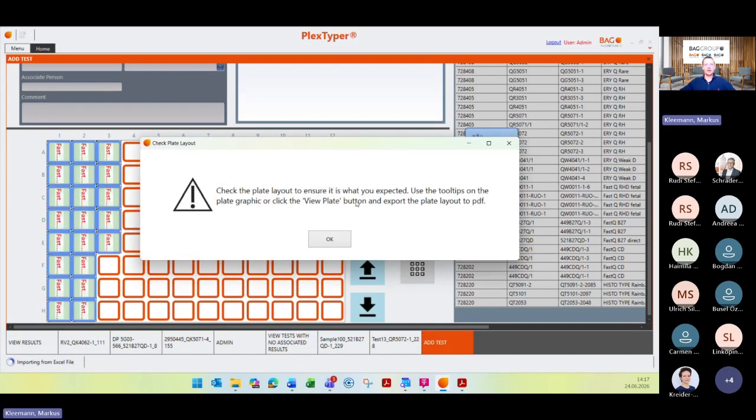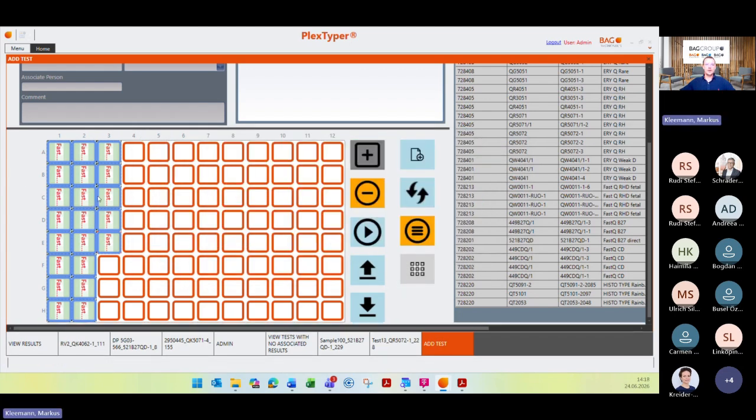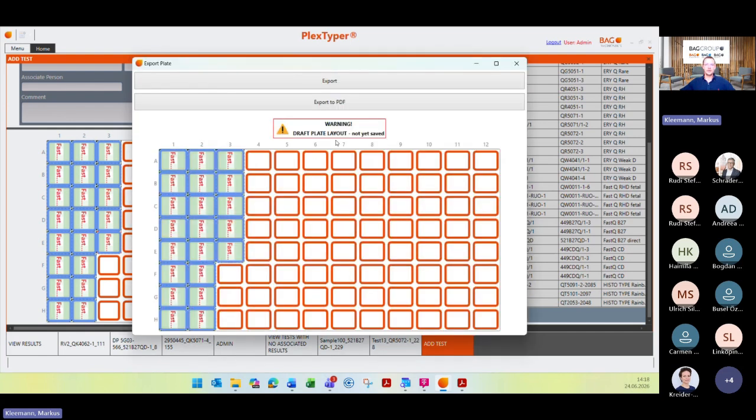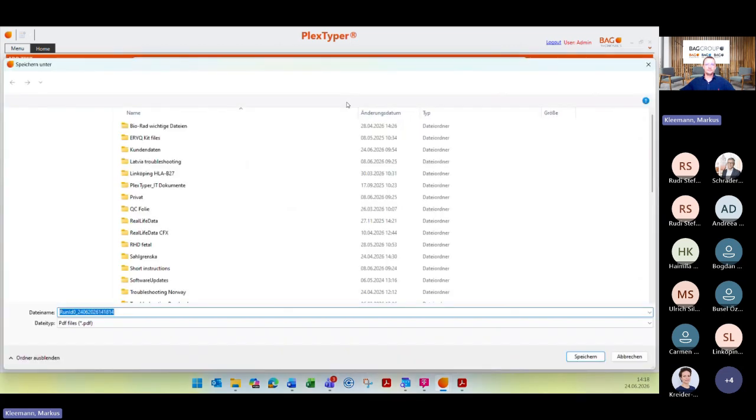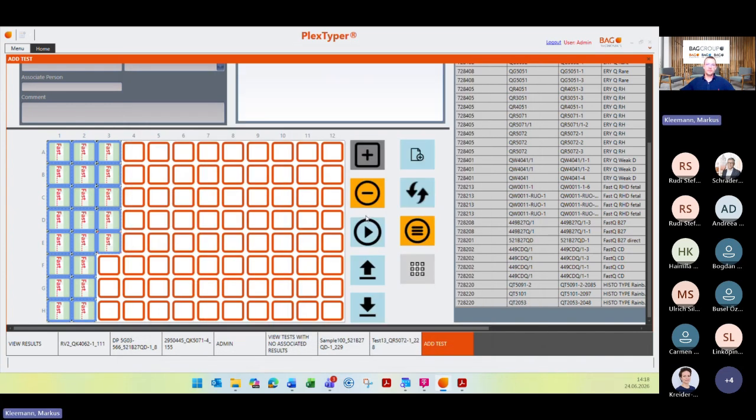And then you get this remark here that you have to be sure and check the plate positioning, and also that the samples are in the correct position. I click OK here. And then again, what you may know is you can print this layout as a picture like this, or as a PDF where you have this table. I can show you shortly, which is, in my opinion, the better option, because you will see the sample name and also the kit file.